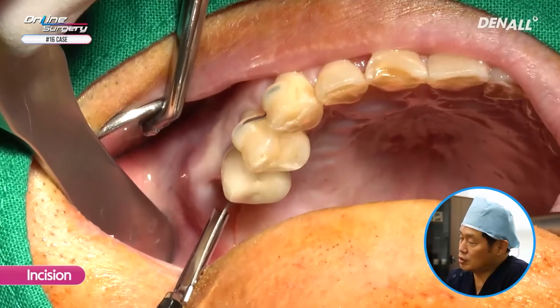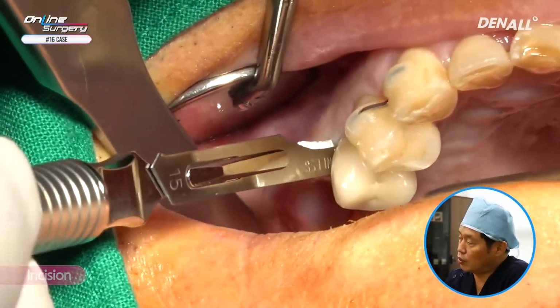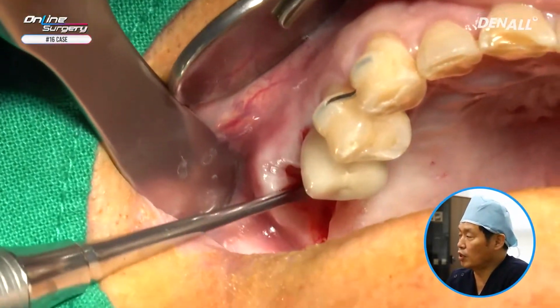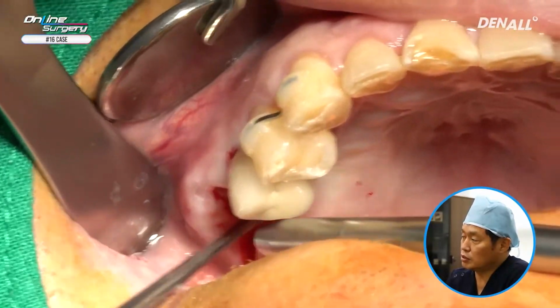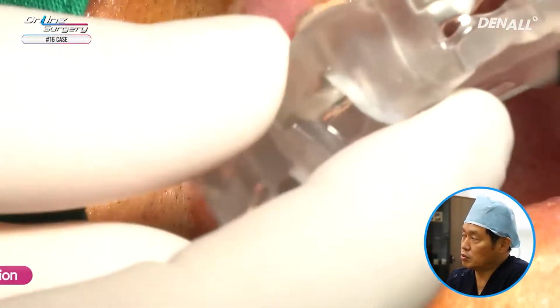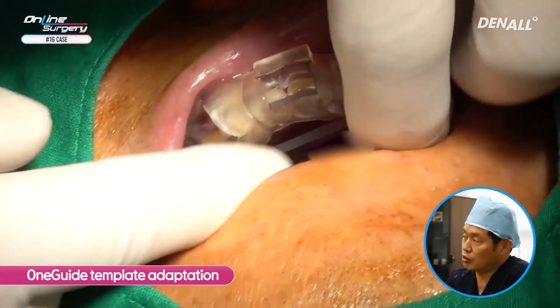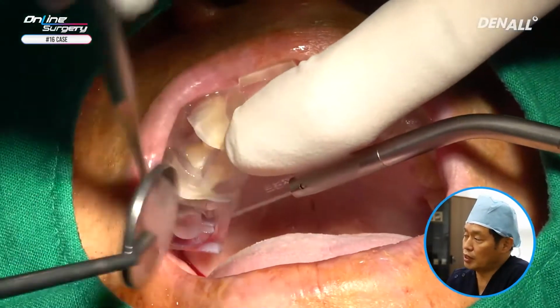Incision is being done. It is made from the distal side, almost as if you're pulling it. The reason why we make an incision is because when you use OneGuide, a lot of people use just a tissue punch. But for this patient, there's an insufficient amount of attached gingiva, so a small incision is made and the flap is reflected and the template is connected.